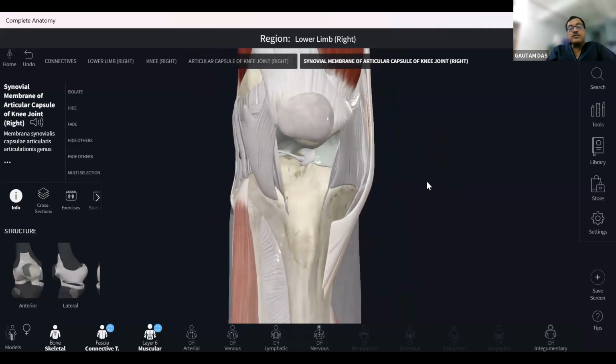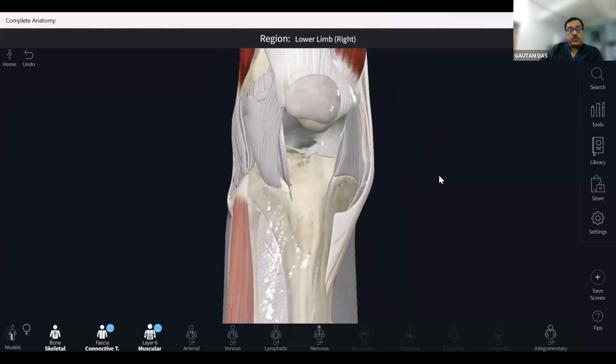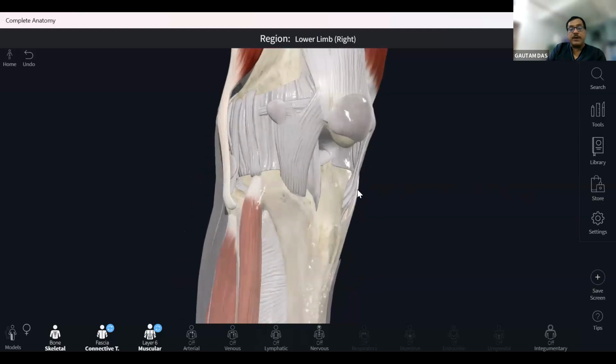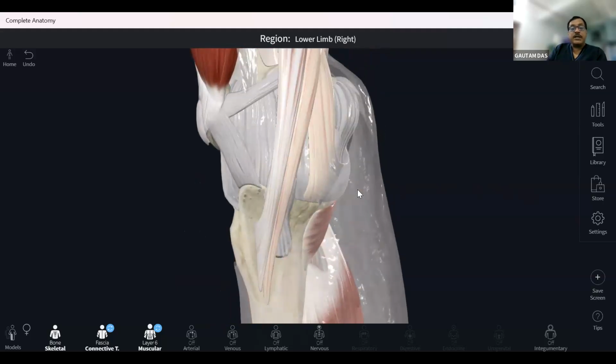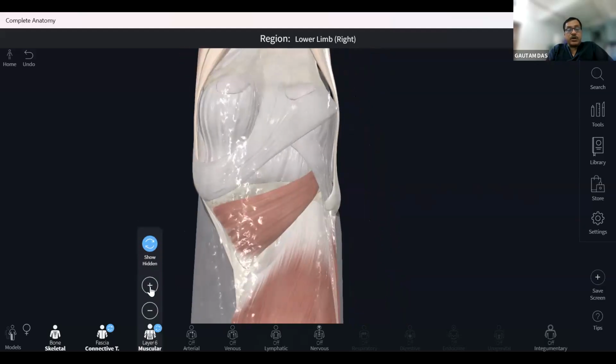I don't know why it is not shown. Okay. Anyway, so this was from the anterior part, the ligamentous part. Posterior also I showed. The medial part, the medial collateral ligament, I already told. Medial collateral ligament, medial patellar retinaculum, and patellofemoral ligament. So these are the ligaments. Then let me remove these layers and let me talk about some of the nerves there.